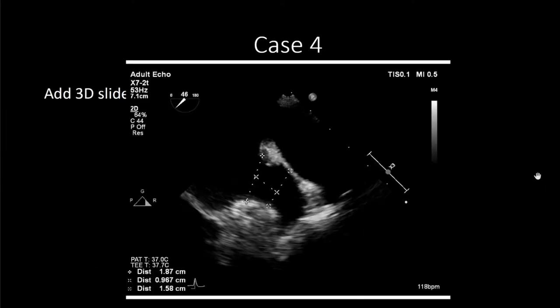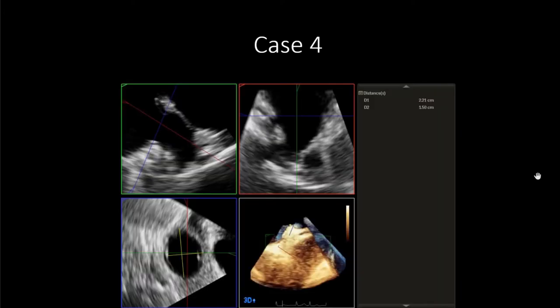There are a couple of ways we measure the appendage in the cath lab. We do 2D planar measurements in two different views, measuring right at the orifice as well as a centimeter in to where the landing zone will be. We do it on 2D imaging, and then we also get a 3D data set and do the same thing on 3D. In 3D, a lot of the time you align your plane, and we have two perpendicular planes lined up at the orifice. You can see it's a nice oval orifice, which gives us a nice measurement for the cath lab.